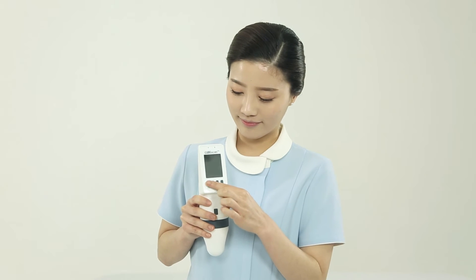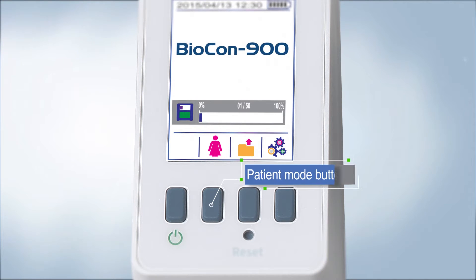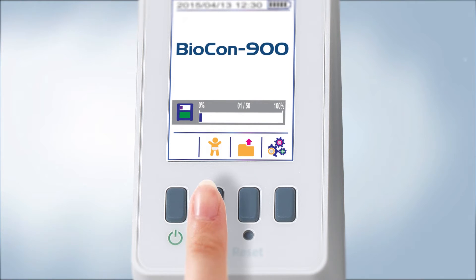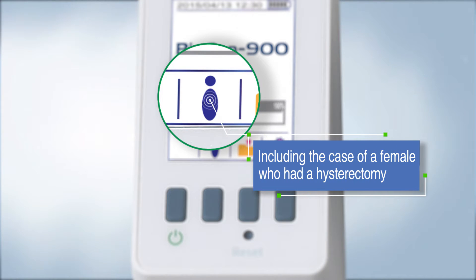First, press the power button until the screen turns on. Please select the patient type when the power is turned on. You can see the female, child, and male icons. You have to press the male icon if you are a female and have had a hysterectomy.